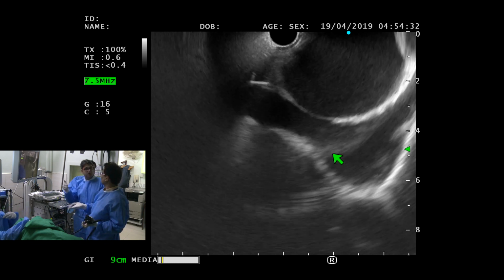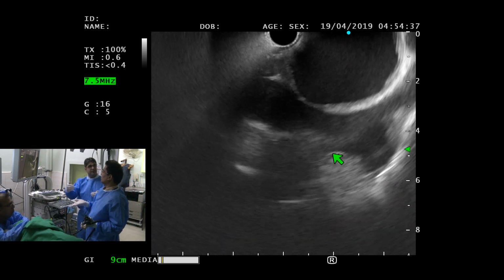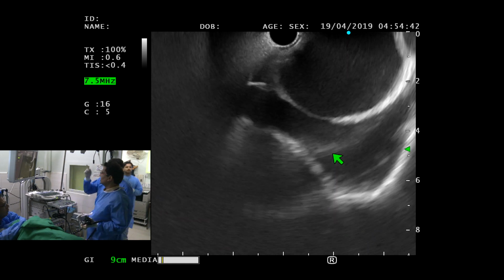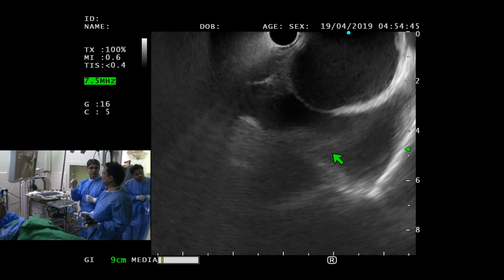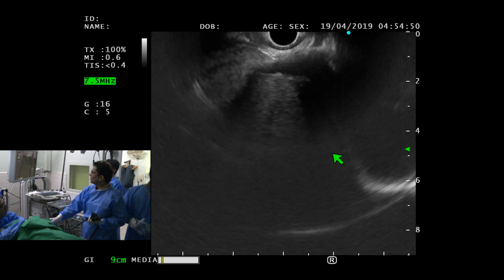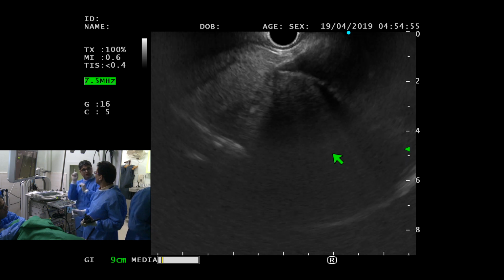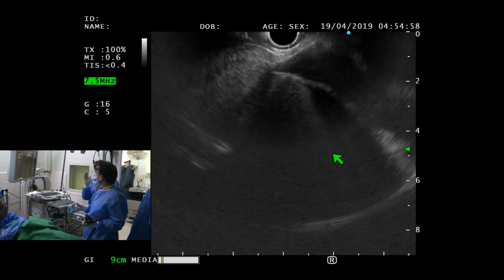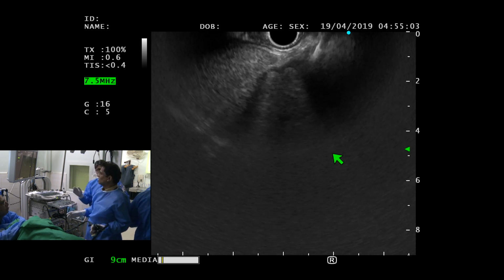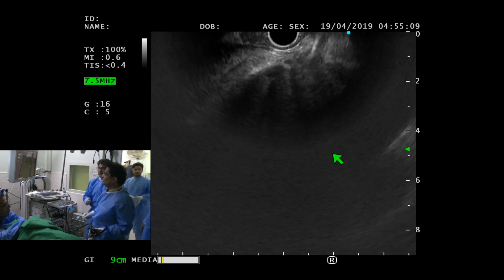So if I reach the GOJ, sitting in the esophagus, with the scope looking at the anterior of the patient, what structure will come between me and the patient's esophagus? Diaphragm and then the liver. Liver, of course, right? So you know that your first landmark would be liver. Let's just see. Okay? So all you have to do is, when you see that the border of the heart is coming, you really need at that point a 3 to 4 centimeter push without any torque in the neutral position, and all you're waiting for is the first guiding structures to come on the screen. Okay? Go for it now.